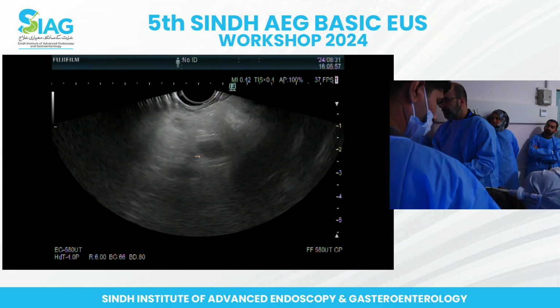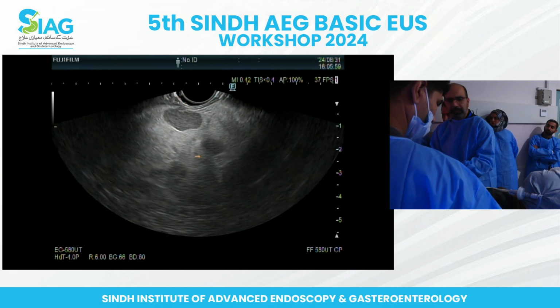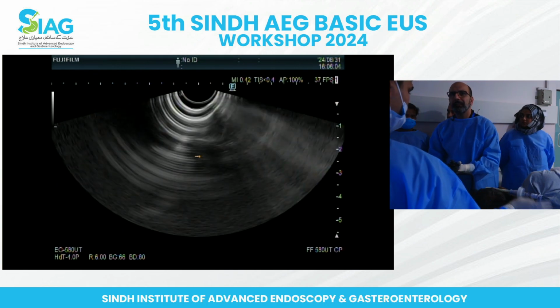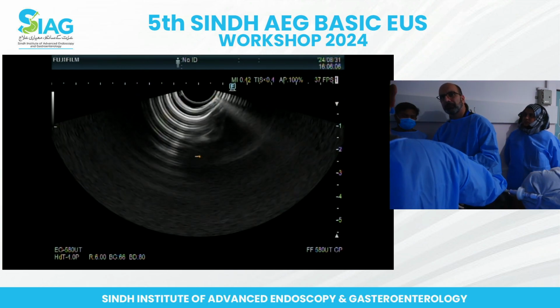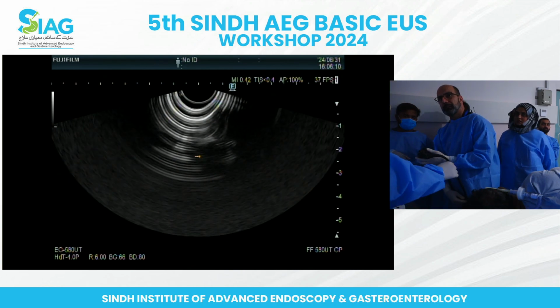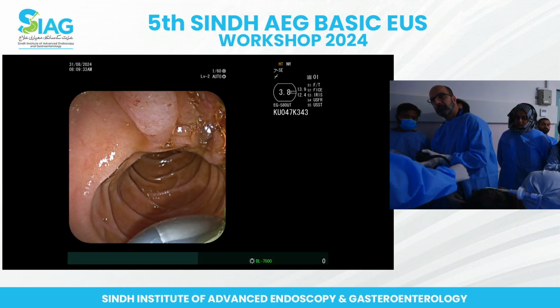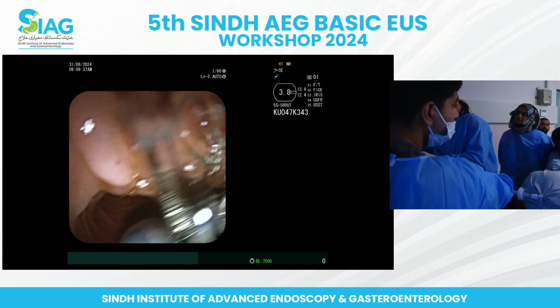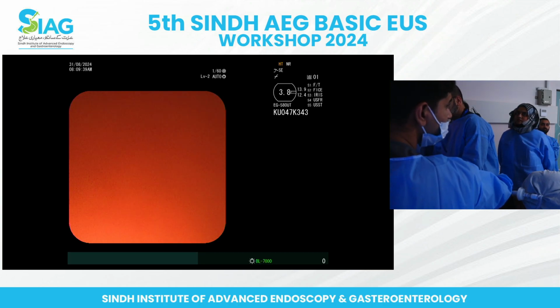These definitely don't look very concerning to me. Where was the mass? I'm not sure. I mean, unless we do, I think, forceps biopsies of this.